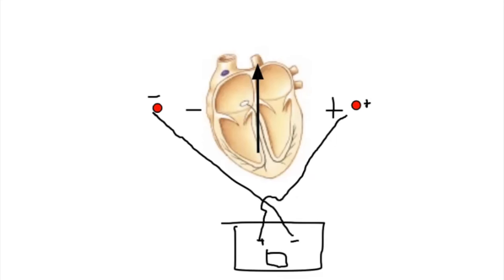Why is it important? The arrangement of these electrodes is important. So what are we missing with just these 2 electrodes? Vertical component. Right, there's no vertical component. So whenever the dipole goes up out of view, we can maybe assume how much of it is in the up direction, but we don't know. Okay, and if the dipole is straight up, we can't tell if the heart is quiescent, not doing anything, or if it's doing a lot of something in a direction that we're not measuring.